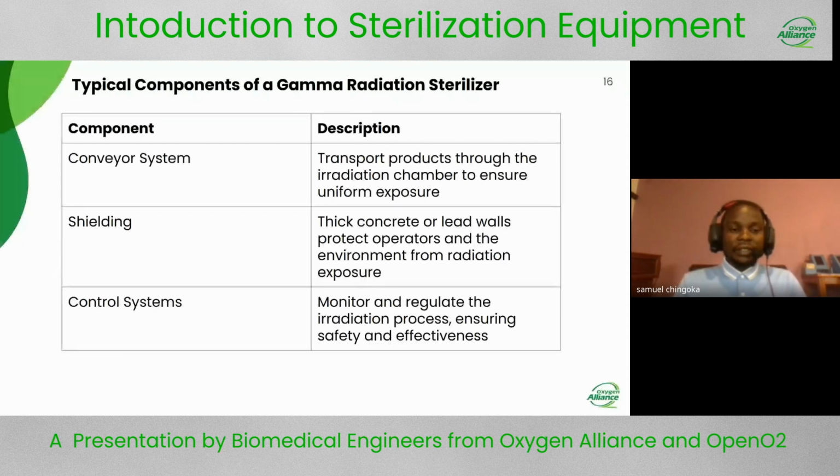within the exposure. So we also have a shielding. It may be thick concrete or lead walls, which protect us and the environment from radiation exposure. We also have a control system, which we use to monitor and regulate the radiation processes to ensure safety and effectiveness.